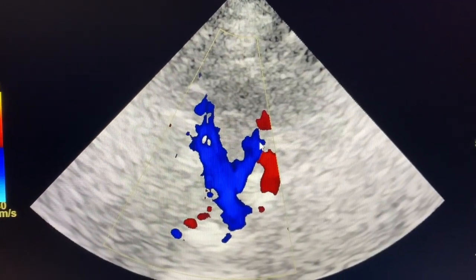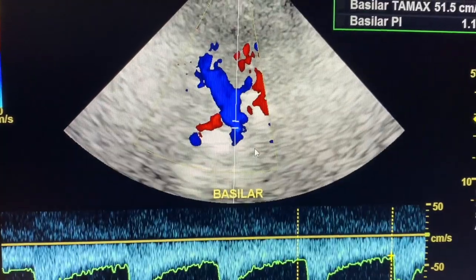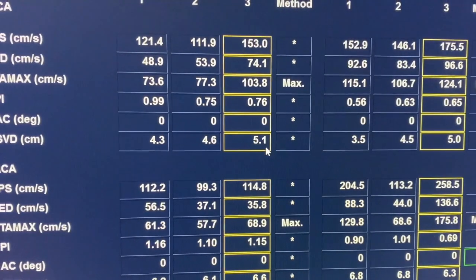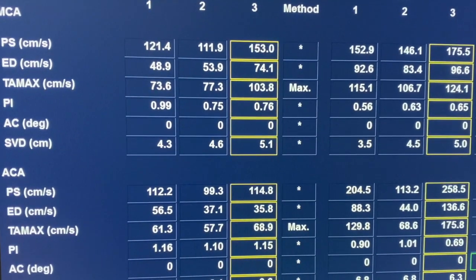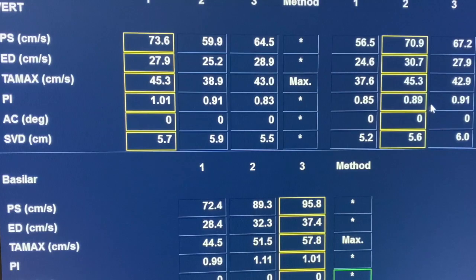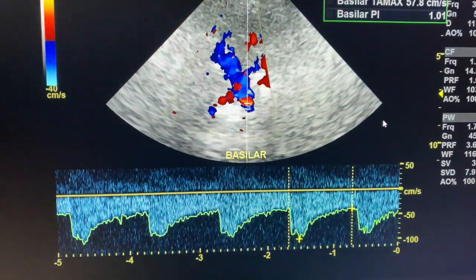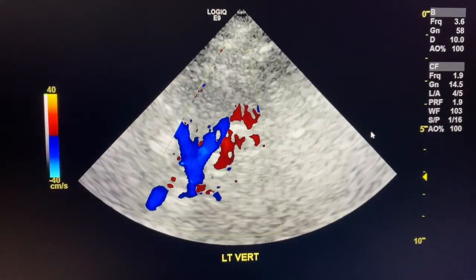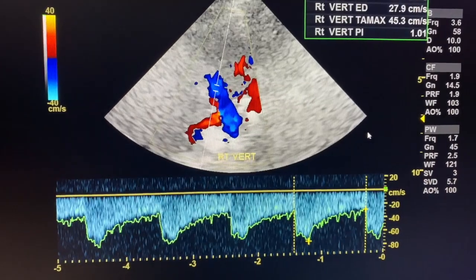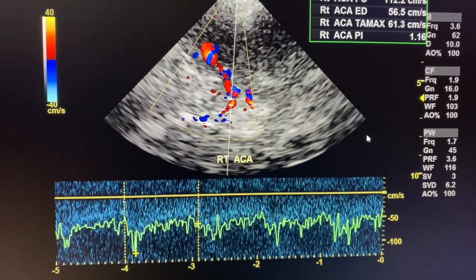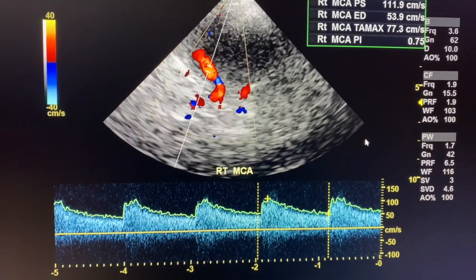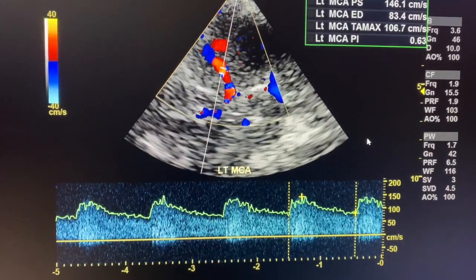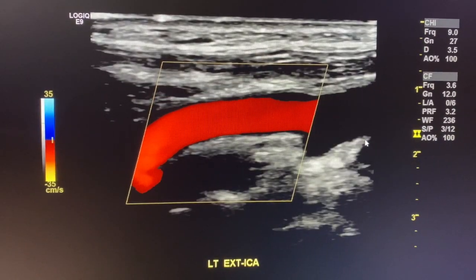We also survey the basilar artery, just like the other vessels, taking three images each — you can take more, but three is good. We take the T-max, and that gives us our velocities. That's a transcranial Doppler in our hospital. Other places may do it differently — there are also PCAs (PCA 1 and 2) and more that can be seen, but our protocol is bilateral MCAs, bilateral ACAs, bilateral vertebrals, and the basilar. Hope you guys enjoyed!